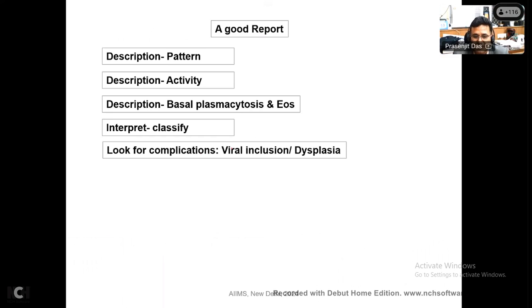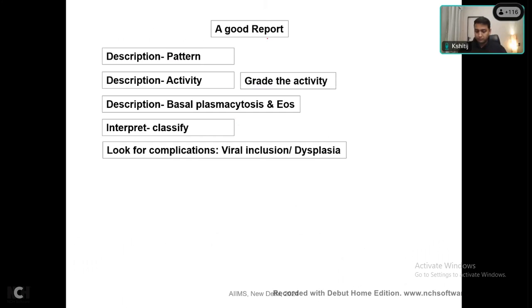If you remember my message, viral inclusion and dysplasia, please comment always. So what did I not mention? Please look at the points. I have mentioned everything we discussed today. So what is left, anything to supplement that? Look at the points: pattern, activity, basal plasmacytosis, eosinophilia, interpretation, classification, and complications. We discussed these today. So what is left? I always told you, another important role of anatomic pathologists is that you have to grade the activity. Okay? So please remember everything.